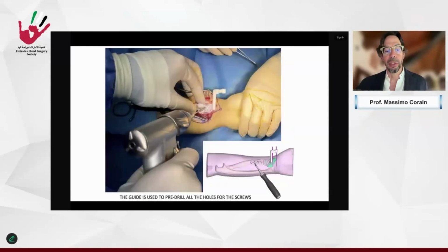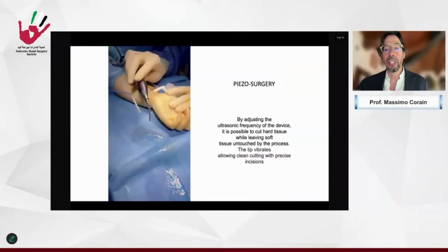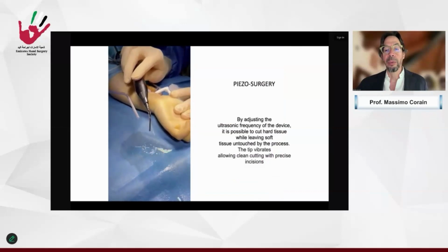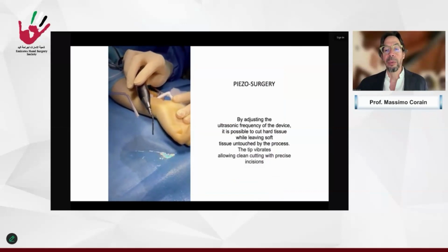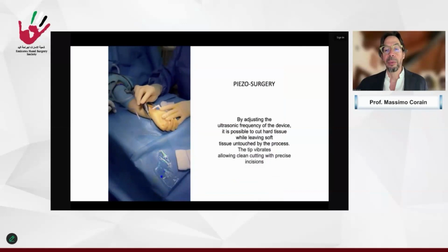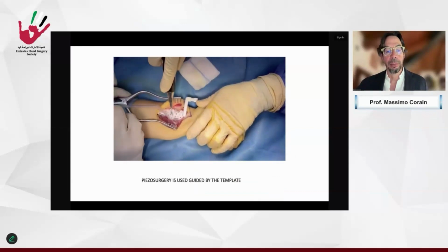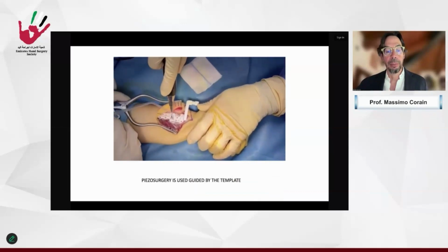And so the guide is used to pre-drill the holes. And this is the piezo surgery. You can check the ultrasonic frequency of the device, and you can cut the bone, the hard tissue, while leaving the soft tissue. And there is a vibration with the water that avoids the heating of the bone. So this is the piezo surgery in the guide.